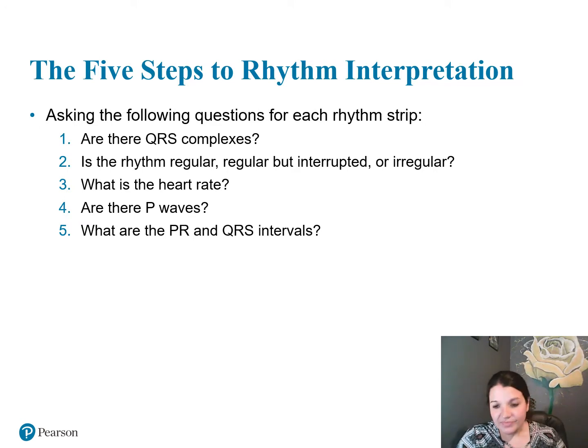So, how do we interpret these rhythms? Guess what? You already know. You already know what to do. We're going to ask ourselves the following questions. These 5 questions, commit to memory. Write them down on that note card I told you about, and don't forget what the 5 steps are.